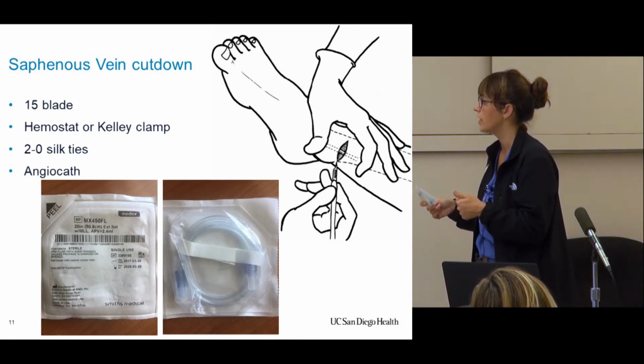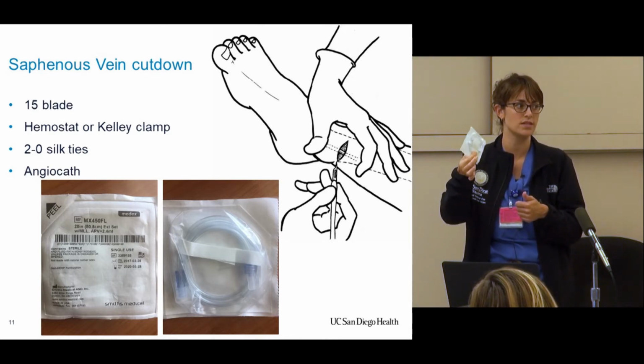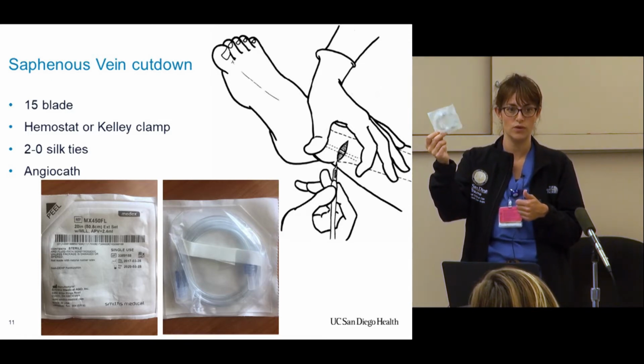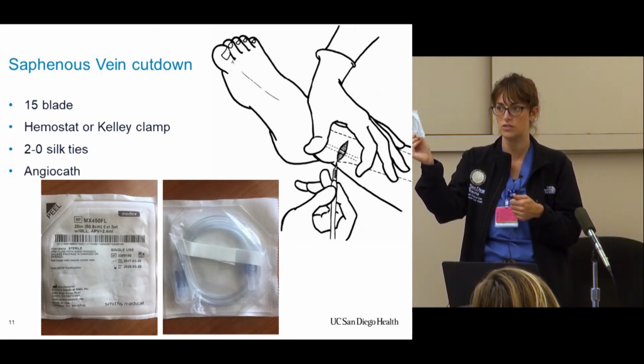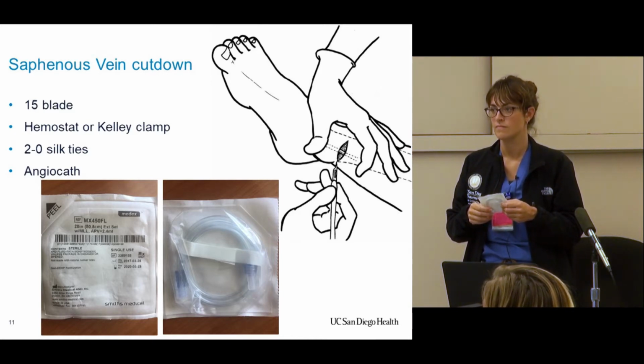That would be best. Sometimes the veins are too small for these, in which case the angiocath will work better, but just know they're going to be yelling at you for this. So where's the connector? Where's the tubing? You want a connector. I've gotten stuff from other centers where they sewed it into the veins and there's no break point. So you're like, oh, great.